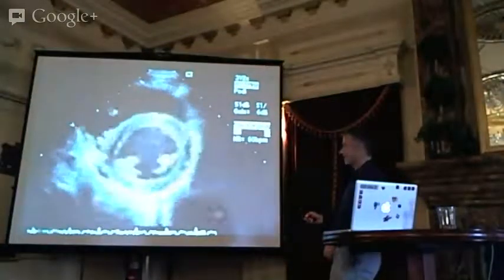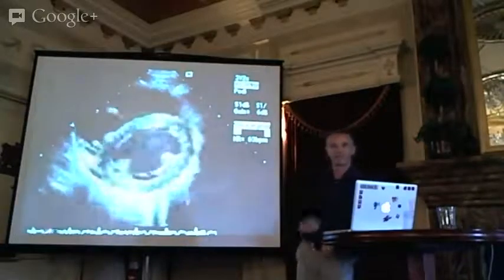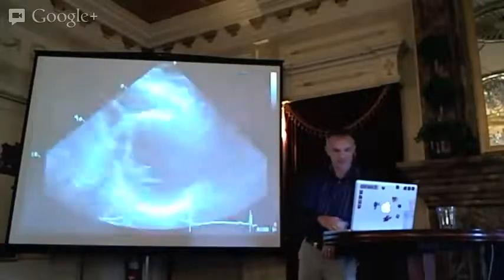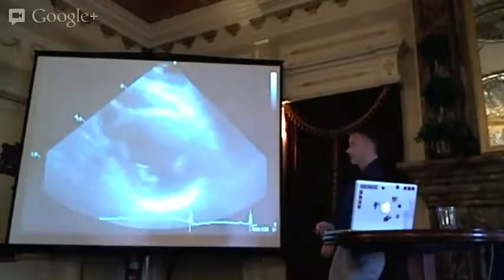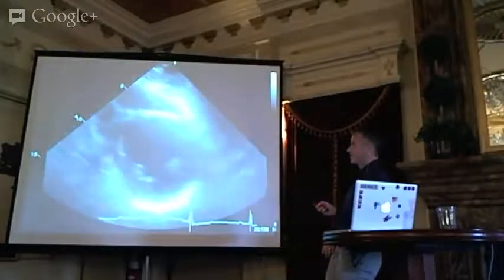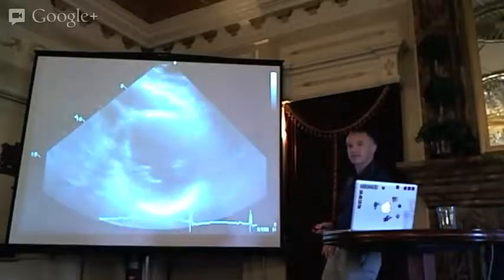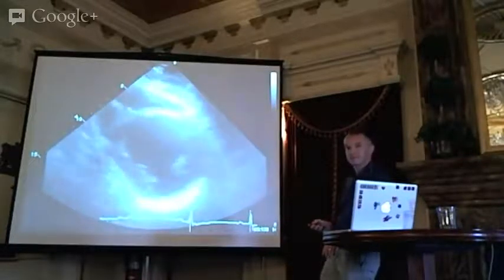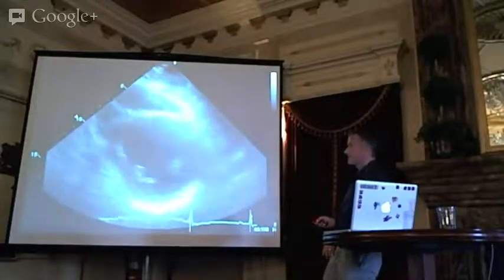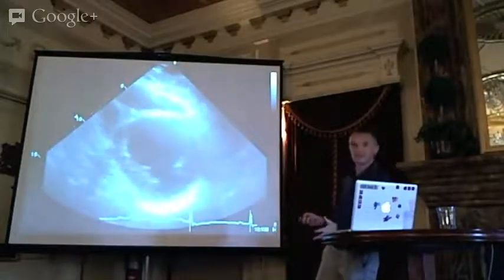Anyway, so here's another short axis view. Let's say a patient came in with a bit of chest pain and some equivocal anterior ST segment change on the ECG, not really sure if it's cardiac or not, then you get this short axis view. Is there fluid around the heart? No. Is the RV bigger than the LV, pushing on the septum and flattening it? No. Is the LV contracting evenly all the way around? No. What do you see? The septum isn't really moving much here, is it? This is bad down here, but that's not really doing anything. So that's a septal regional wall motion abnormality. I think that's cool, isn't it?